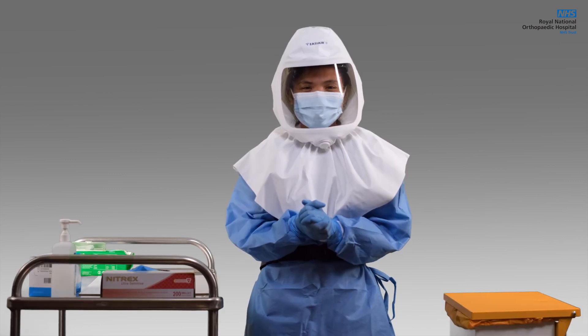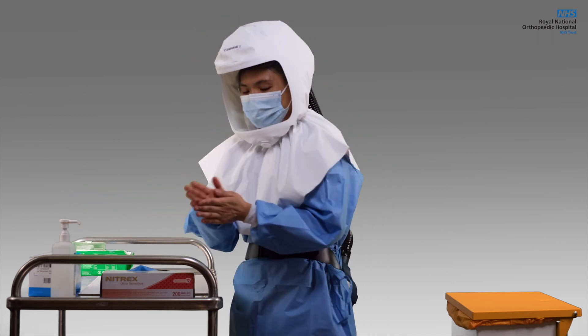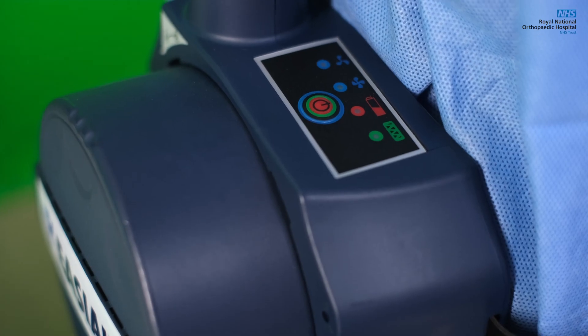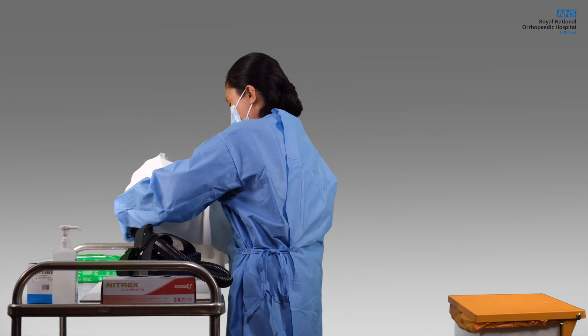After use, make sure you are out of the aerosol generating procedure zone before taking the hood or the unit off. Discard your used gloves appropriately and clean your hands with alcohol gel. Use another set of gloves, then turn off the unit by pressing the red button. Ideally, you will lay the unit on a table.